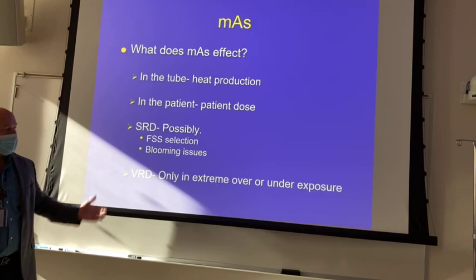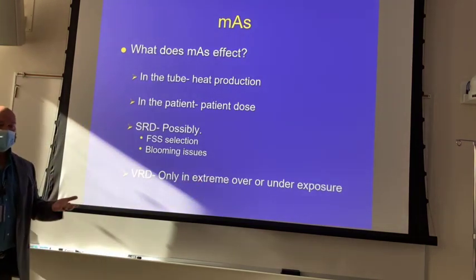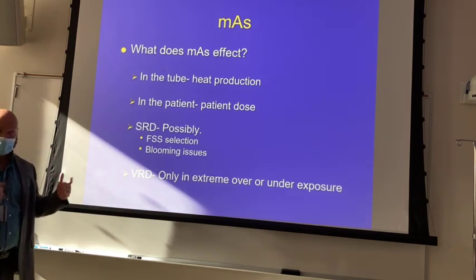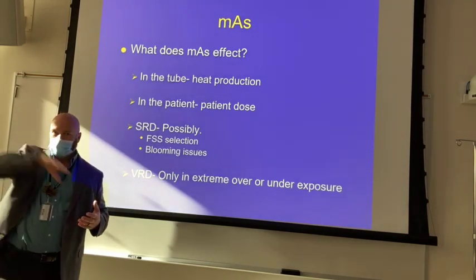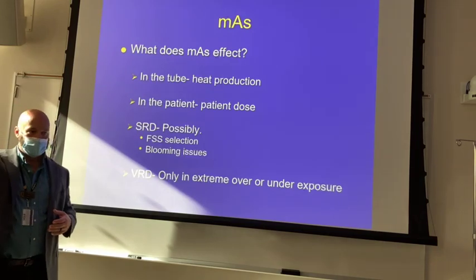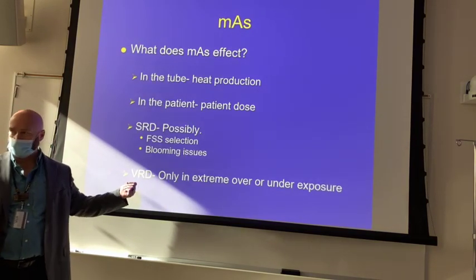So in that way, if you overexpose the patient to a point where you fill those image receptors up completely, where they all reach maximum density, the sharpness is still there, but you've got so much density you can't see it. And that applies even to your digital image receptors. So if you overexpose to where, think about your H&D curve, all of your exposures are in that shoulder section, then you have no contrast, right? And if you have no contrast, you have no visibility or recorded detail.